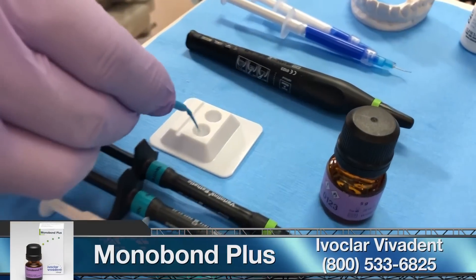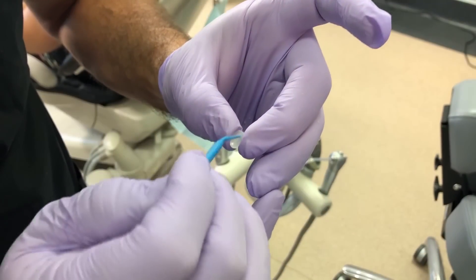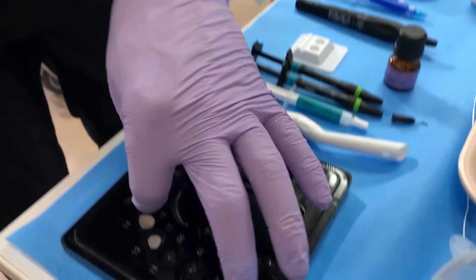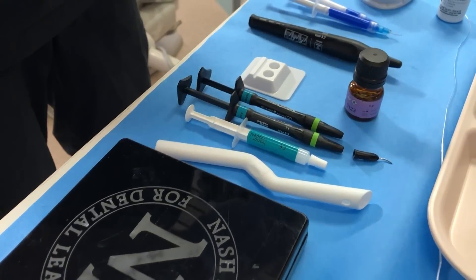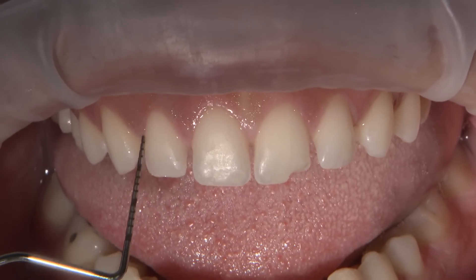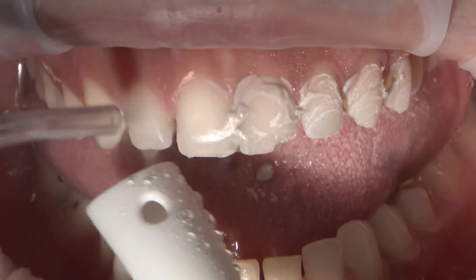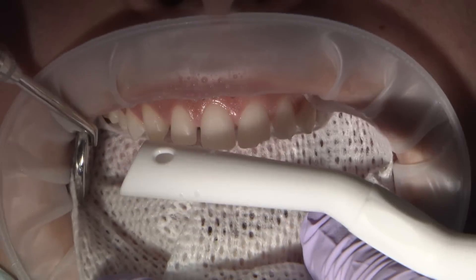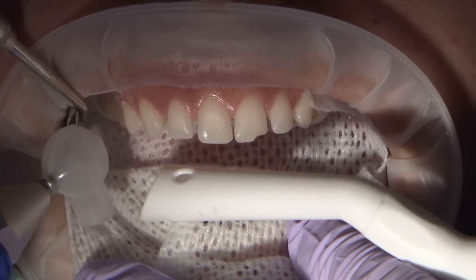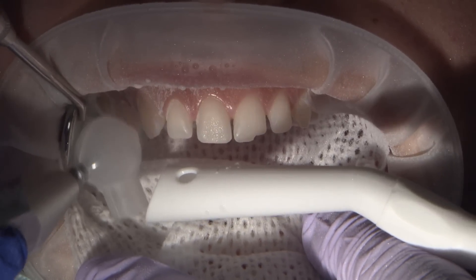Will is applying Monobond Plus to the intaglio of the veneer. This has MDP primer added to it. The methacrylate organic component of the primer will facilitate the formation of chemical bonds with the resin component of the cement. No preparation was done on this case, but in order to prepare the teeth for etch and bond, I pumice the surfaces to take off the biofilm. Then I sandblasted to remove the aprismatic enamel so I can obtain a more uniform etching pattern. Research shows that the aprismatic layer is interfering with the etching process, resulting in lower resin adhesion.